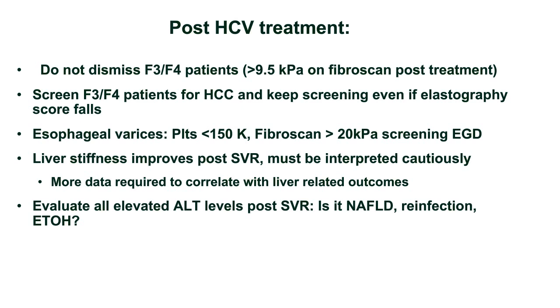patients? Yes. That is a limitation of the elastography technology: when the abdominal wall thickness gets too considerable, even though the XL probe can be very helpful, there still are individuals where you have difficulty. If you are getting findings of considerable stiffness, then again, please use your other non-invasive biomarker tests as well. If you feel the FibroScan is providing a clinical assessment of liver stiffness that is just not what you think clinically, then you sometimes have to go to biopsy.